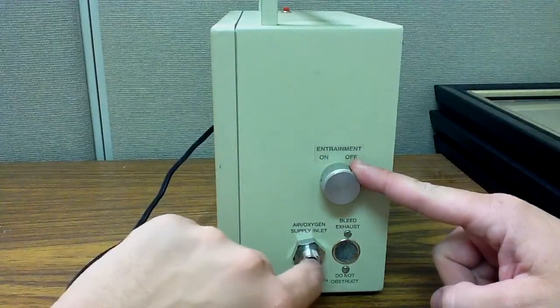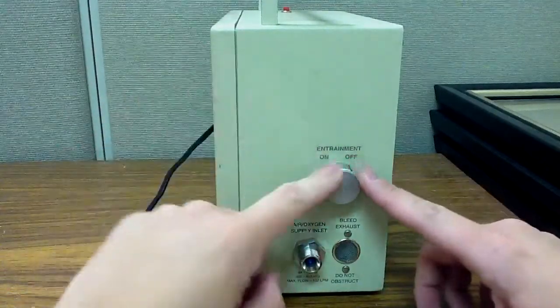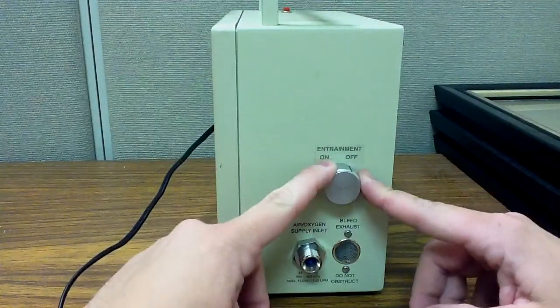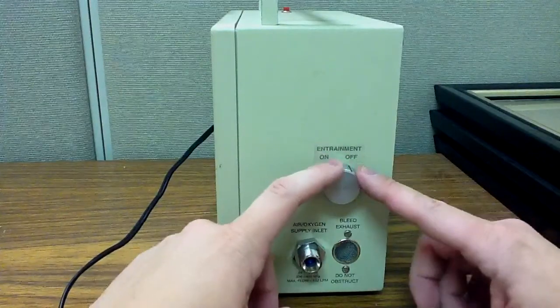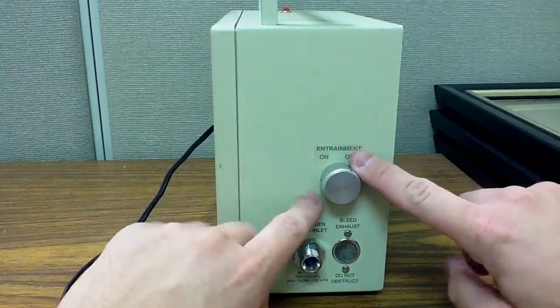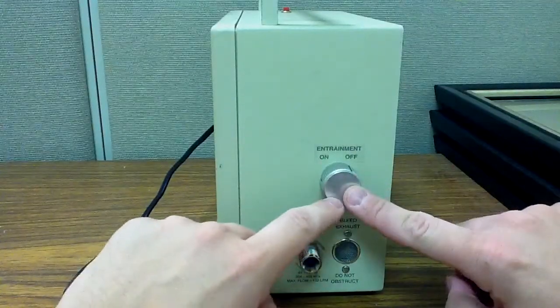Every bit of oxygen that's coming into the high-pressure source is going to be delivered to the patient by the ventilator. So what this means is my FiO2, whatever my patient is getting, will be 100%. There's absolutely no entrainment of atmospheric air. So this will be 100% oxygen.